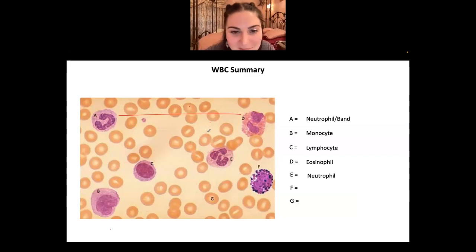This is another neutrophil. Good. So this is another version of a neutrophil. People that said reactive lymphocyte, I get what you're saying because of the indented cytoplasm, right? But reactive lymphocytes look way more like monocytes. They have the giant nuclei. It's not going to be segmented like this. As soon as you see the segmentation, it's still going to be a neutrophil. So this has 3 to 4 segments to it. Even though the cytoplasm is indented around the red blood cells, this is still going to be a neutrophil. But I totally get it with the indented cytoplasm.